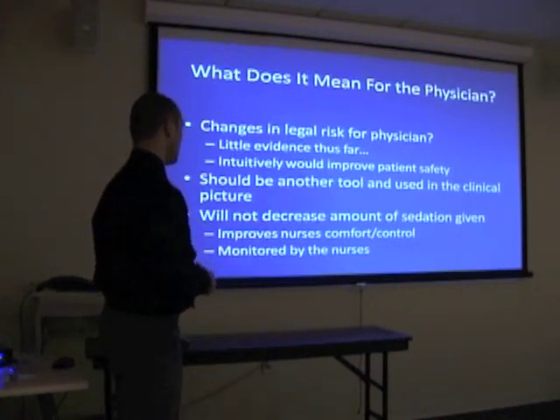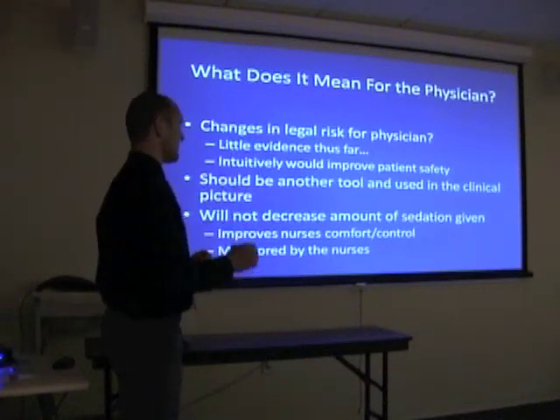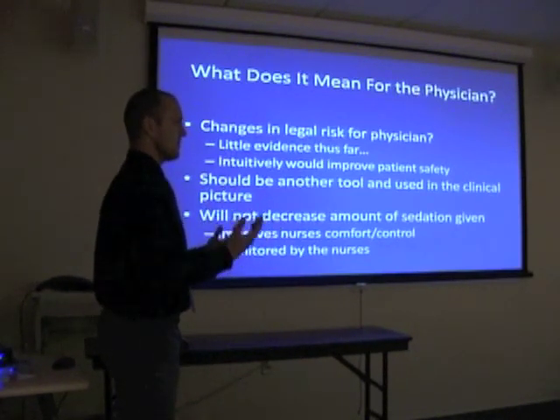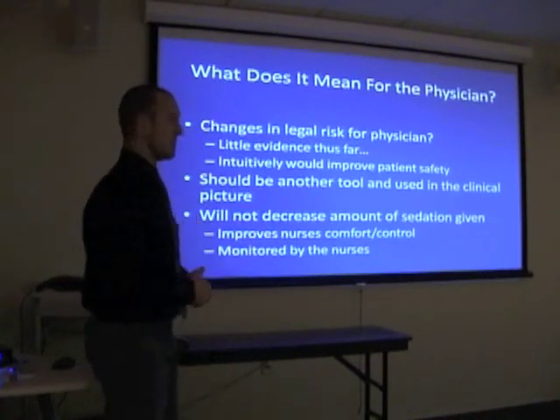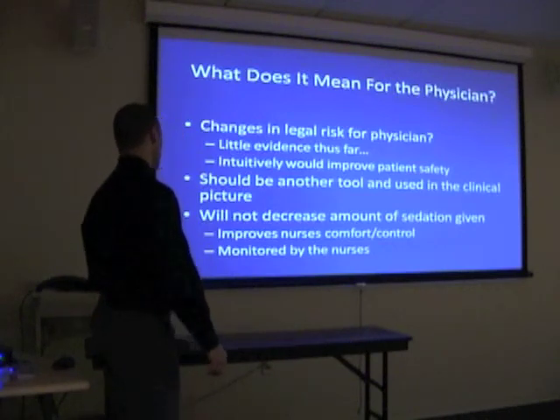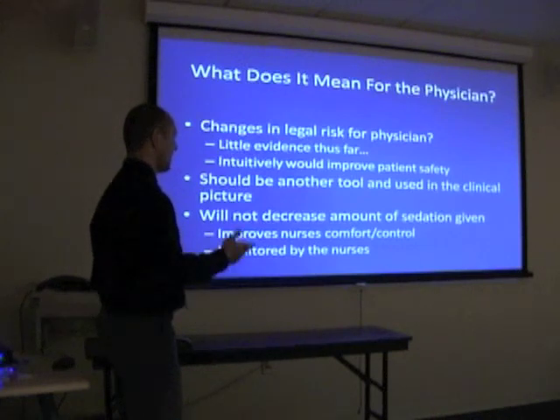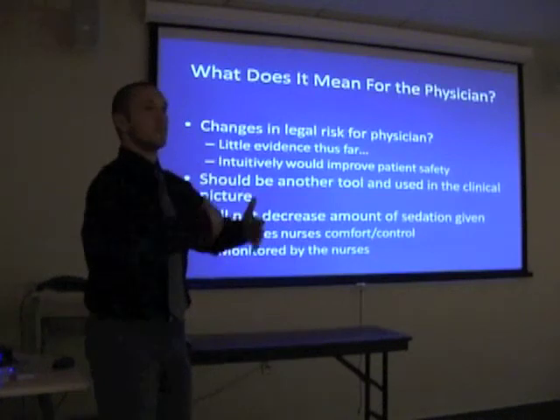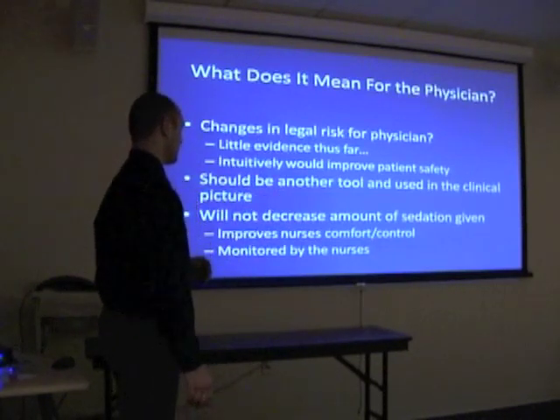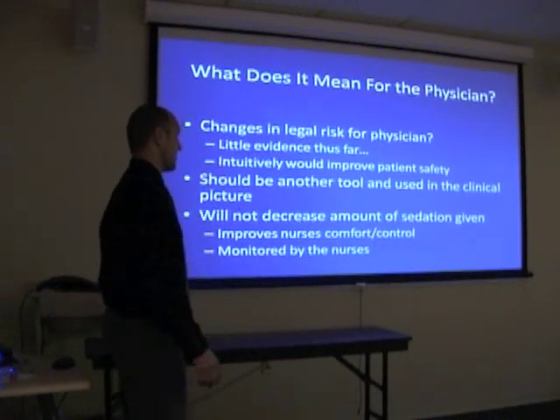It needs to be used as a tool. We've really told the nurses that that's how it's got to be. It's not an absolute number or anything like that. It just needs to be used as another clinical tool to look at. If the pulse ox isn't reading, or you're getting a low number, the first thing you do is check the pulse ox, check the patient. So it's going to be the same kind of process. And from what I've talked to the nursing about, it shouldn't change at all how the nurses are titrating their sedation. I know you guys are the primary people saying, titrate to this effect, or give another bit of this, but I think as it gets more useful, or we get some of the kinks ironed out, it'll actually be better for your guys' sedation.